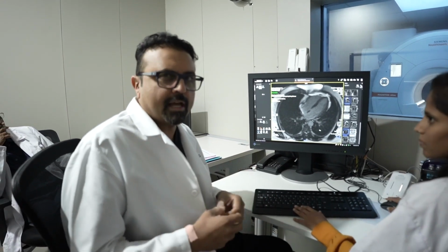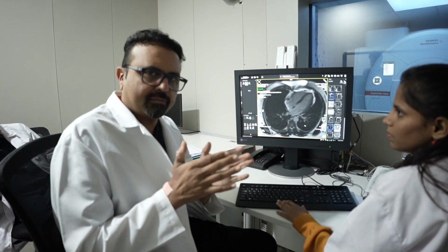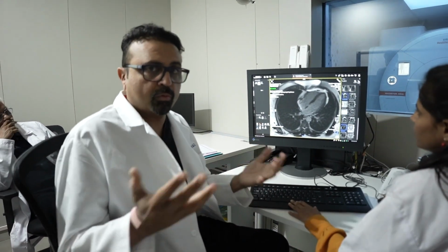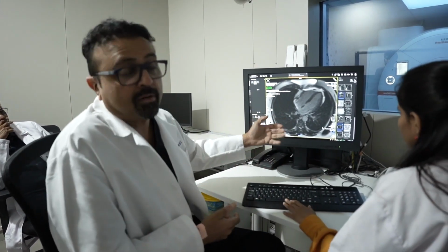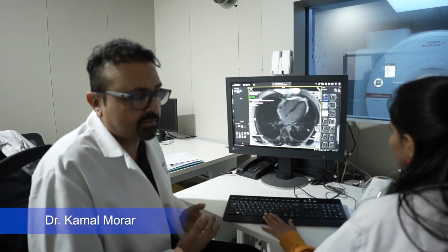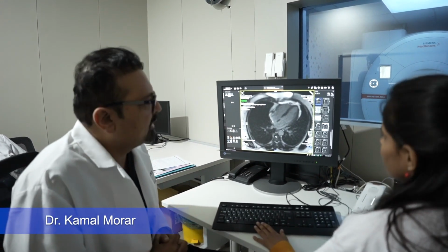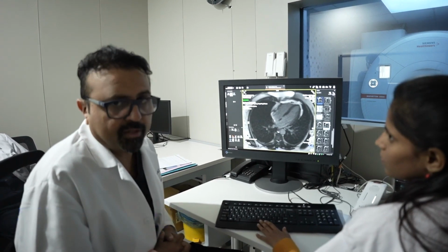If somebody has a heart attack, the muscle dies, and then that dye gets stuck right in that one small area, and it won't wash away. So that's what the MRI, this MR perfusion, is giving us. It's a very unique test. It's very valuable. And when you put this together with that CAT scan, you can get a significant amount of information.